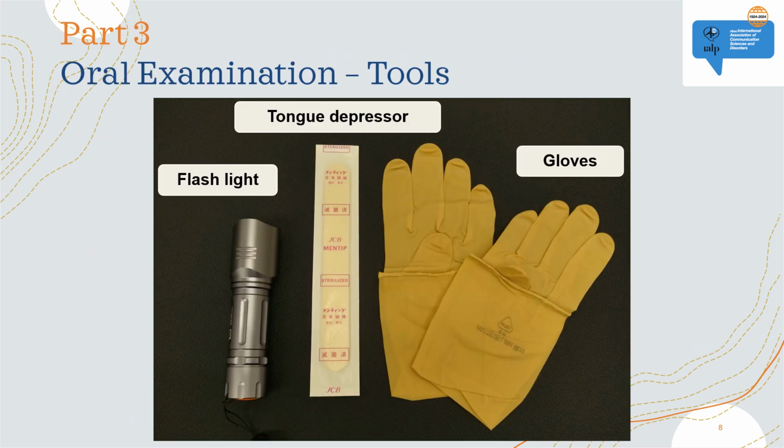Perceptual assessment tells you a lot about the child's speech. We now look into their oral cavity with these tools to see the structural problems, which could be related to their speech problems.